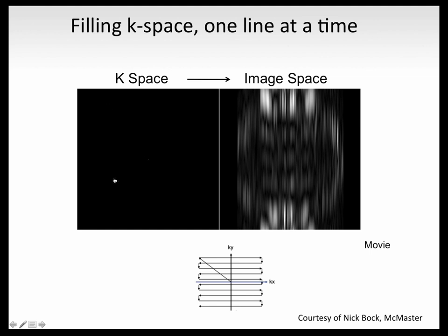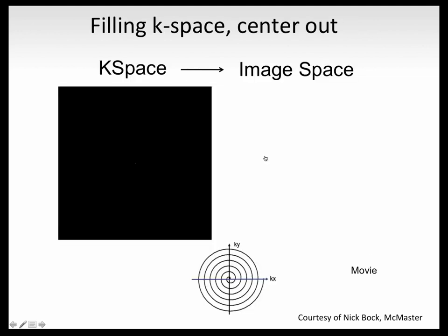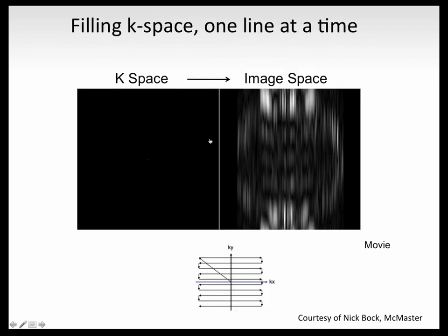What you're going to see here is what is being acquired by the scanner, and it'll be directly Fourier transformed into image space as the acquisition goes. In this case, it'll be sort of like EPI, so it'll scroll down this way. You'll see that the high frequencies will come in, and I'll just run it.